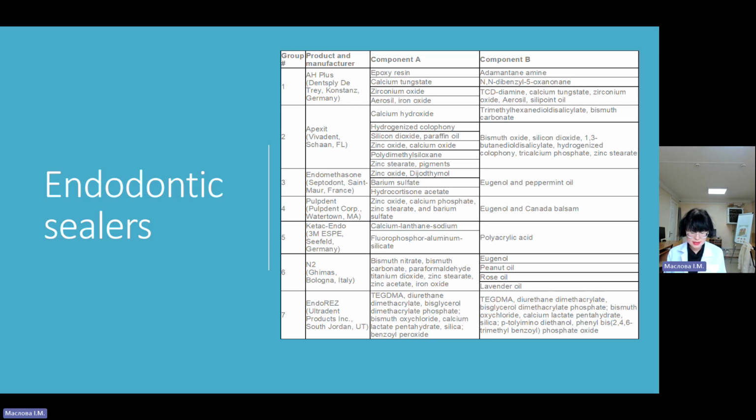Sealers penetrate the dentinal tubules, which can be facilitated by methods such as ultrasonic obturation. This also improves the incidence of filled accessory channels. However, all sealers must be regarded as implantable materials, and so biocompatibility testing is necessary during the development of novel sealer types and delivery methods.